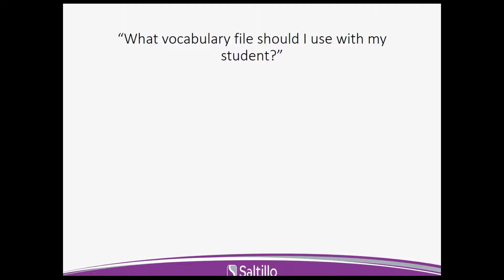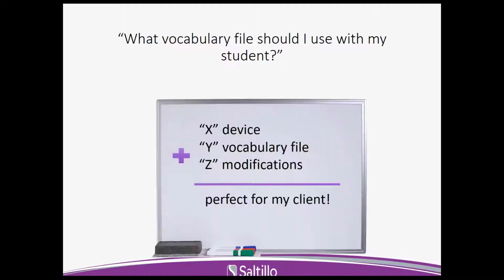As consultants, we are regularly asked, how do I know which vocabulary file to use with my student? There really is no simple formula when we're trying to make that decision. And so, even though we would love to have X device with Y vocabulary file just needs this many Z modifications will make it perfect for my client, that does not exist.